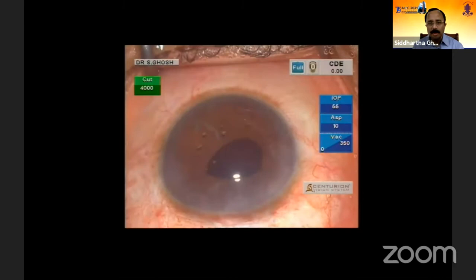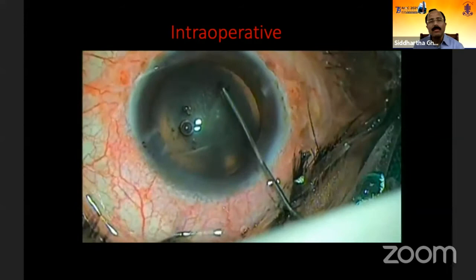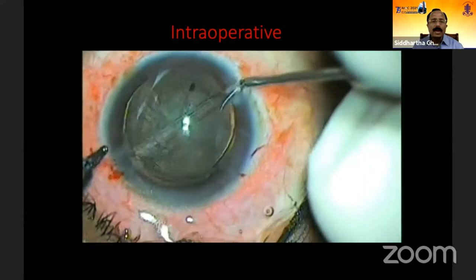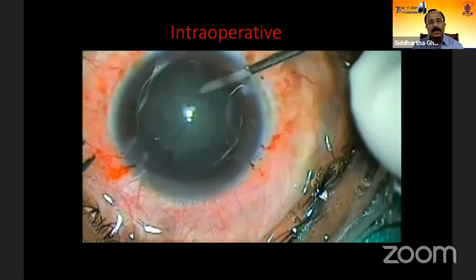Well, this is another case. This patient is a young patient, but had a history of uveitis about 1 year back, but no other history of trauma or anything. So this is a soft nucleus, as you can see. Once the hydro procedures are done, I found that it's not free. So I thought there must be some corticocapsular adhesions. So mechanically, I tend to rotate and sweep, first sweep and then rotate. But I feel that I have done it too vigorously, might have injured zonules. This is one point of caution.